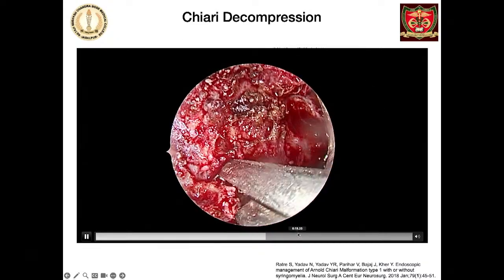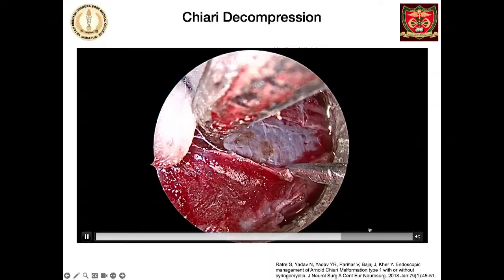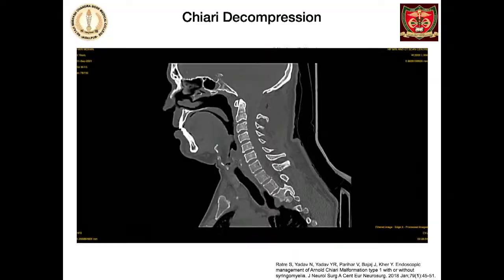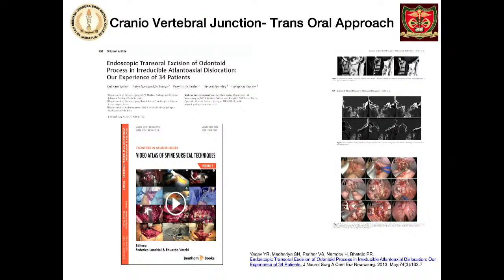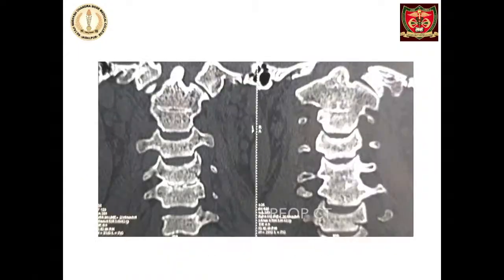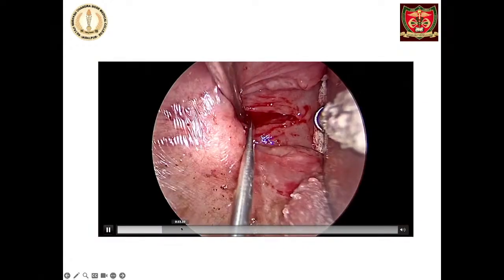First we use the exoscope, take out the, then drill the foramen magnum, and then we switch over to the endoscope. And then the partial splitting of the dura has been done. That is a different sort of debate whether it is required, but in this case it has worked.